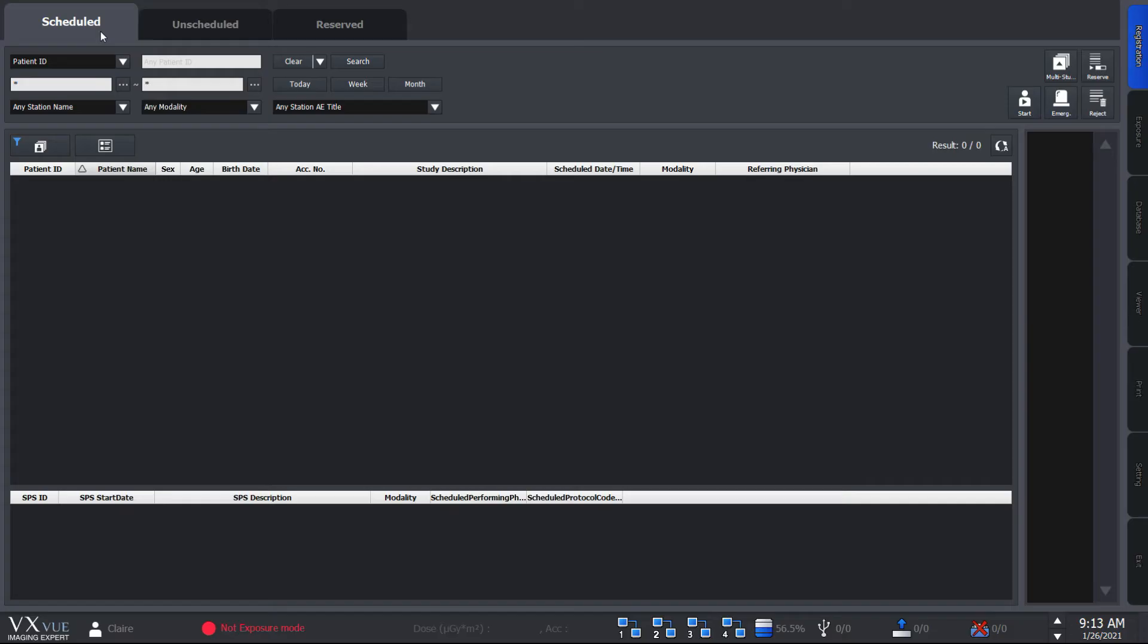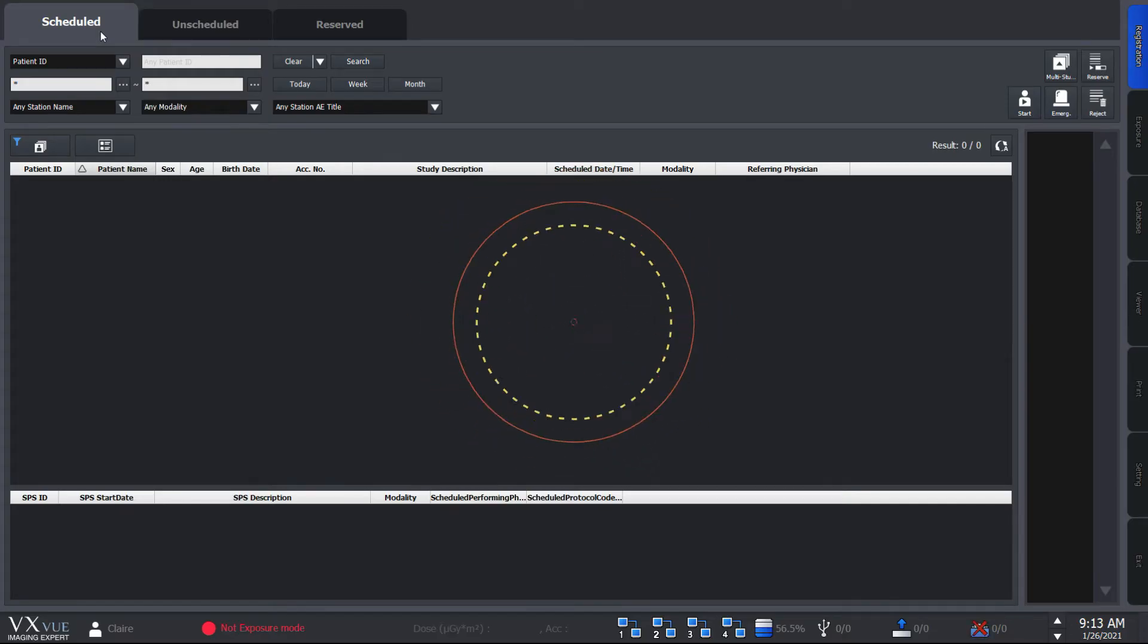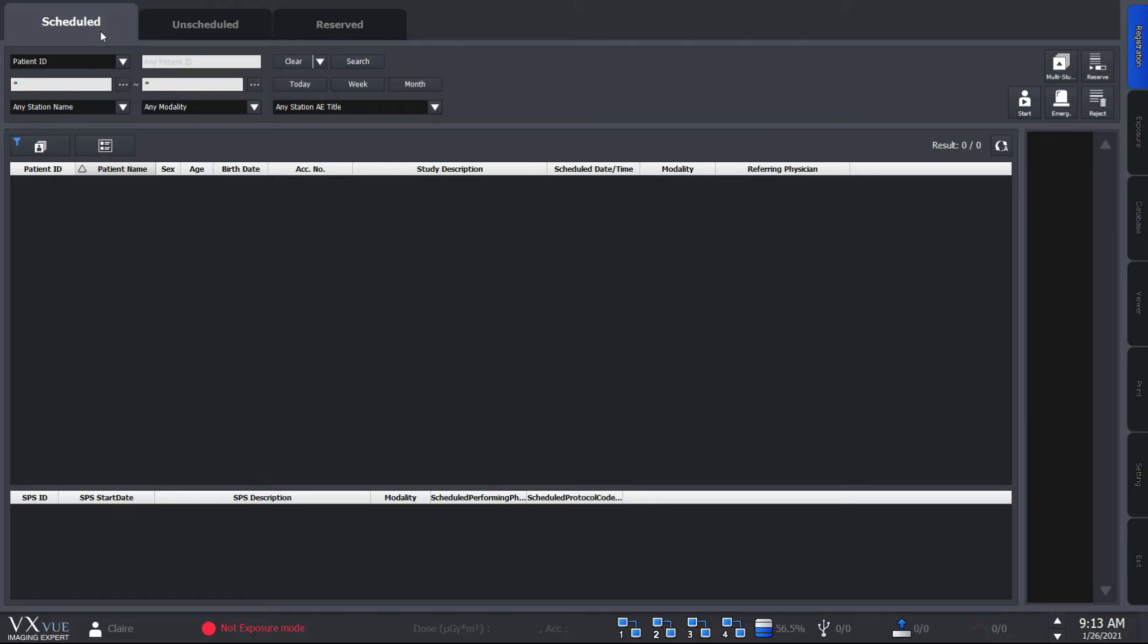So let's first look into the scheduled panel. This is for those who use MWL or modality work list. Naturally, you would first need to connect a work list to VXView to use this panel.